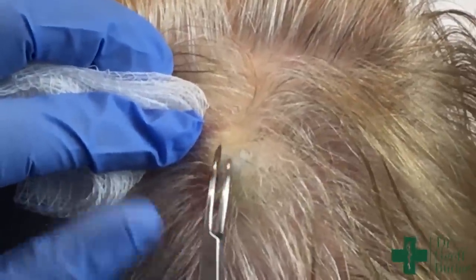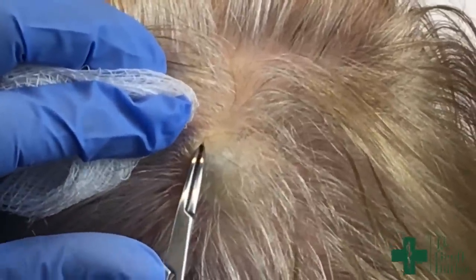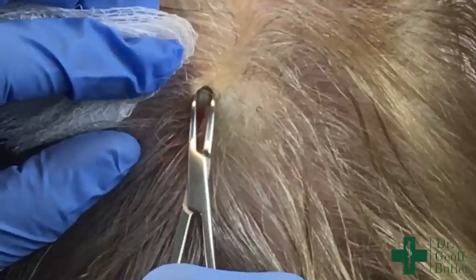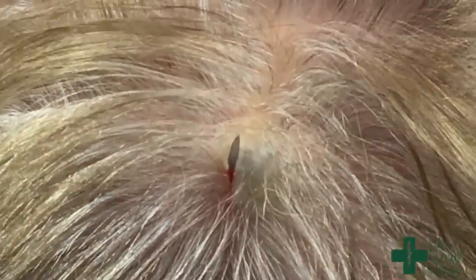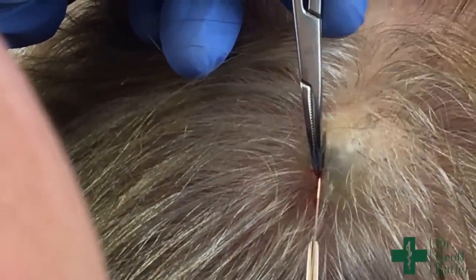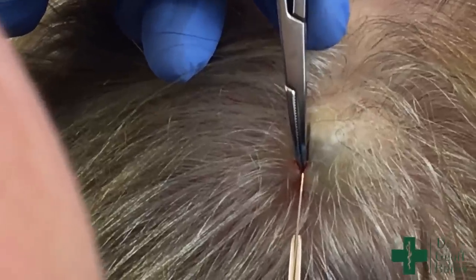You can see here — Matthew, can you appreciate that? So you can see that's the capsule surface. The nice thing is we're into that layer. So all I do is extend that out a little bit. What I'll do from this end is put the cryleys back in from the posterior aspect, and then I can extend this while protecting the cyst capsule.